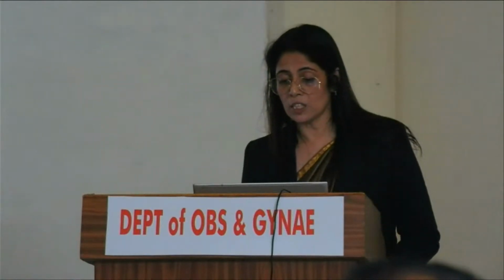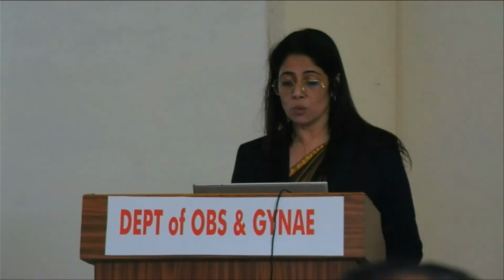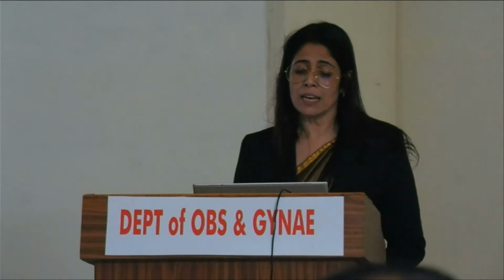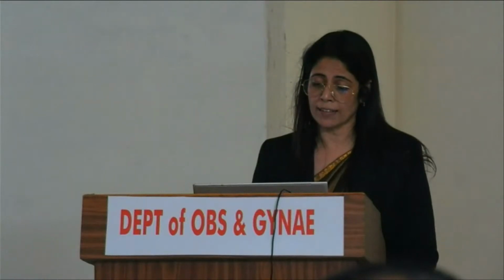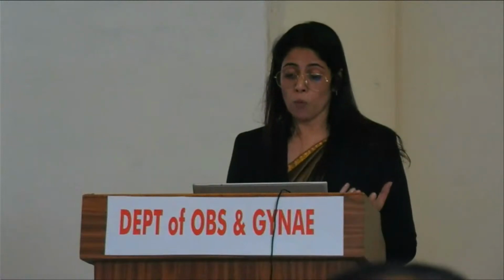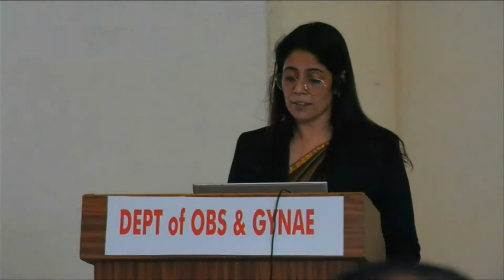Second, we come down and we see the two thalami, and actually the third ventricle is in between these two thalami, and from the thalami, in continuation, are the cerebral peduncles. So we go down a bit and we look at the two cerebral peduncles, and the aqueduct of Sylvius is in between the two peduncles. And if we draw a line along them, they are convergent. And these peduncles are also a bit away from the occipital bone. Now, why is it important? Because, as I'll show in subsequent slides, when there is open spina bifida, these peduncles come and almost touch the occipital bone, and this is an indirect sign.